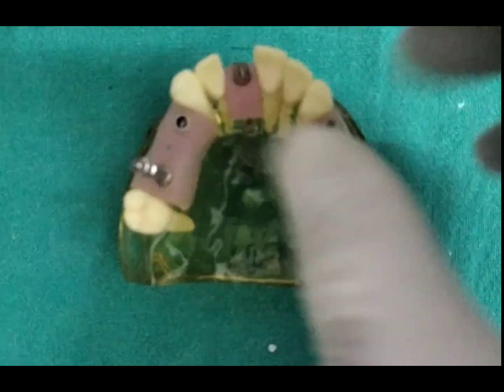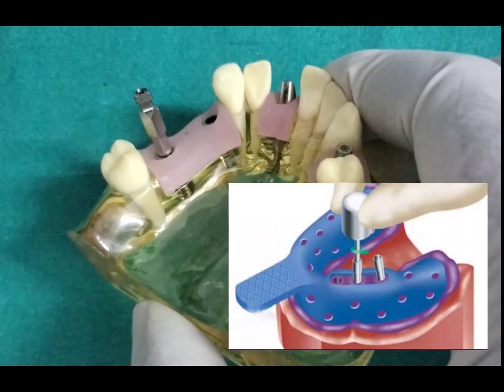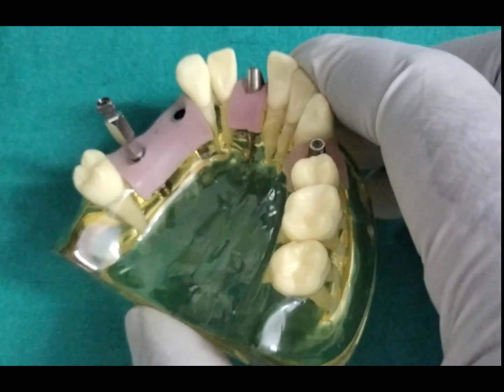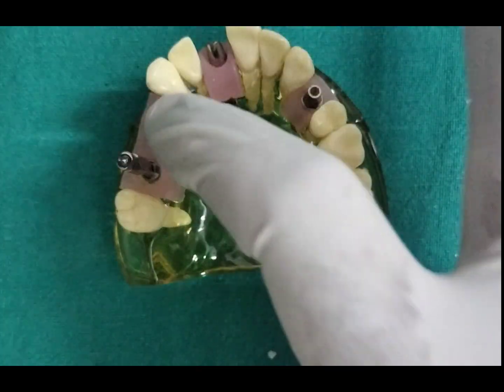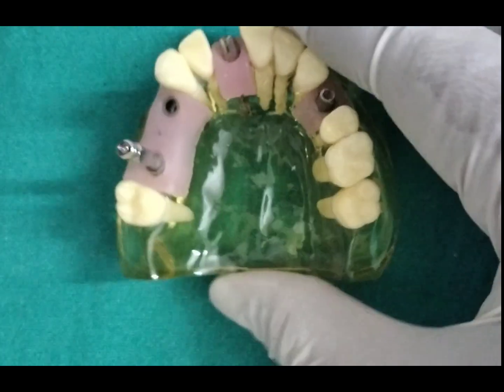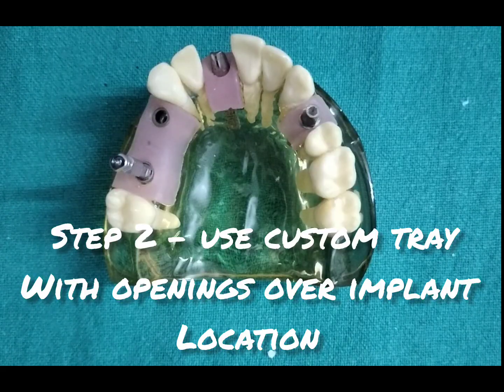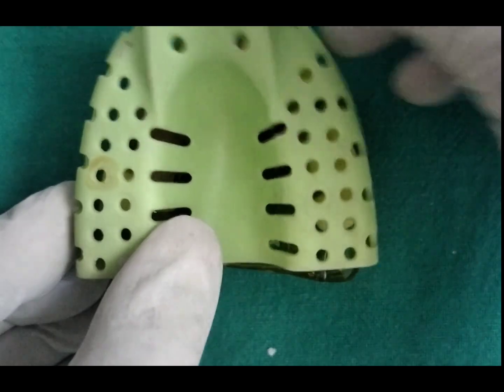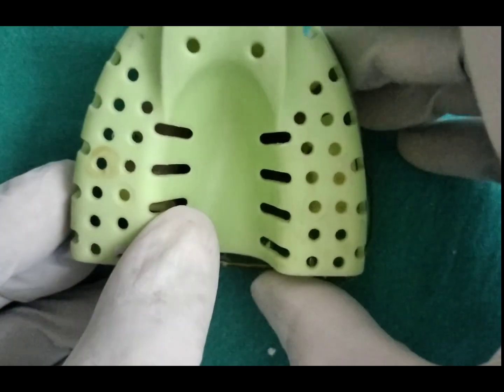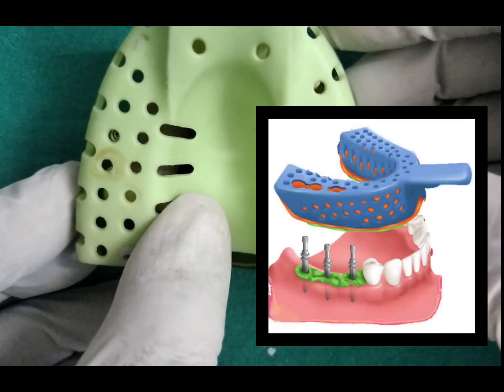This is long so that this part remains outside the tray. The previous one which we were using for closed tray technique was a short impression coping. So once we have the long impression coping, we place it for all the other implants, and we have to use a custom tray. Custom tray is required with openings over the implants. So you mark that and you have to perforate it, or in the lab you get it done. So once this is done, then you make the impression.